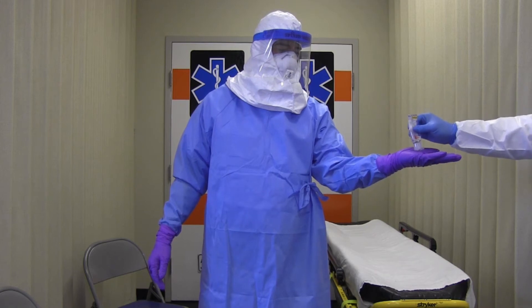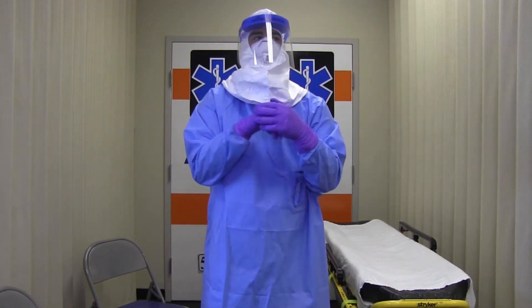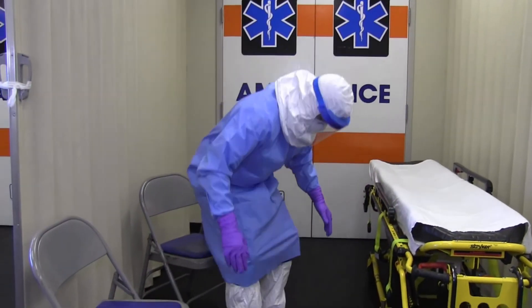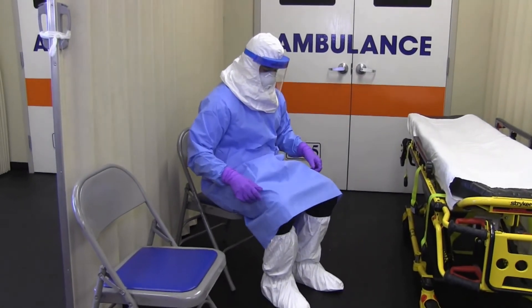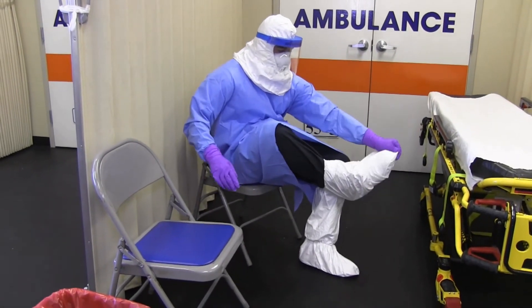Next, you'll disinfect your outer gloves with an alcohol-based hand rub. You'll then remove your boot covers. While sitting down, remove and discard boot covers. Remember, this seat is now contaminated, and for any future sitting, you'll need to select a different place to sit.